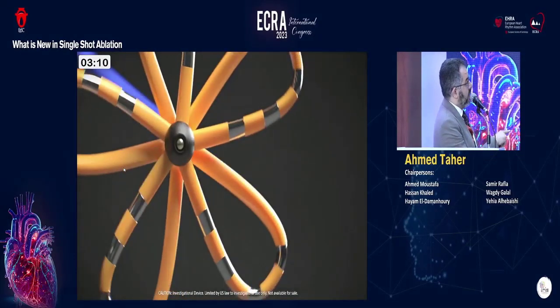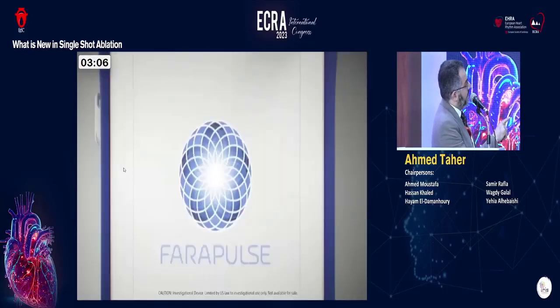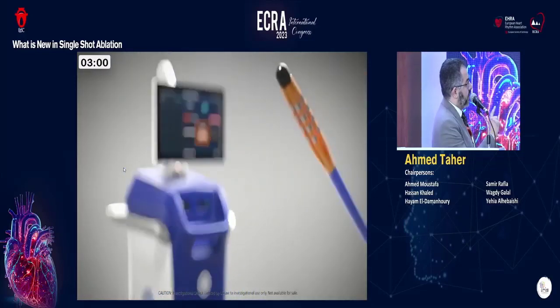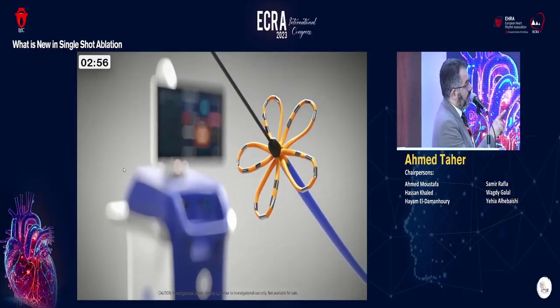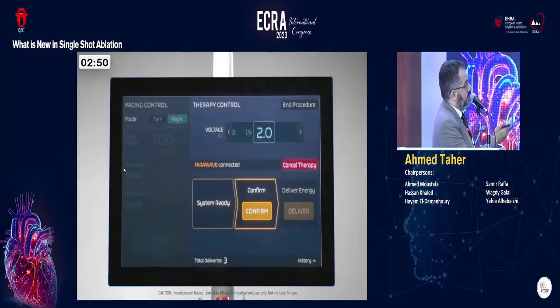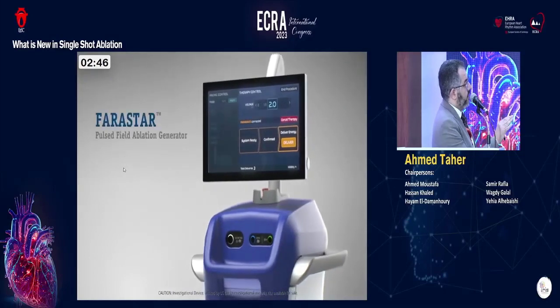This is the catheter Boston uses for PFA. It's called the Farawave catheter. It's a multi-electrode catheter. It has two configurations, something called basket configuration and flower configuration. This is the system. This is the catheter in flower configuration, and it will show again in a few seconds the basket. This is the system, very easy interface. You just select the energy you need to deliver and you press deliver.